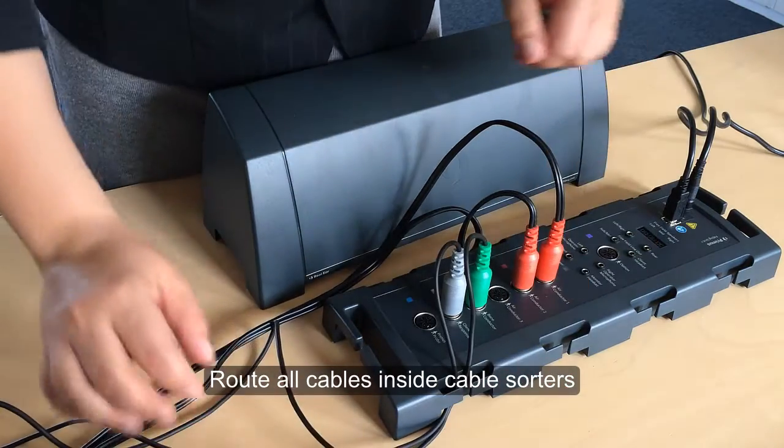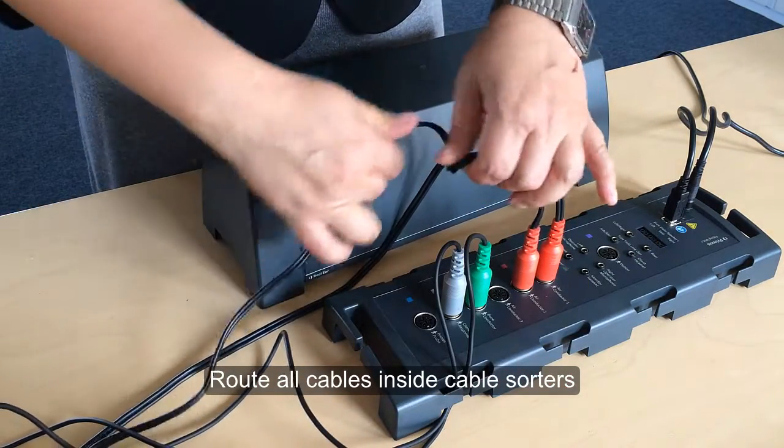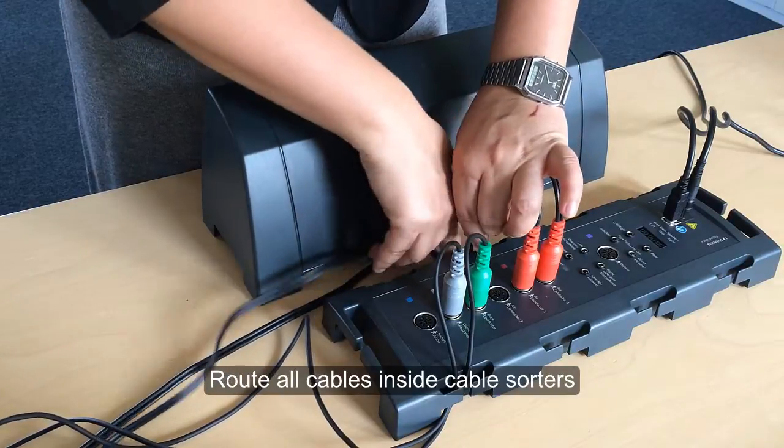Make sure that all the cables are routed using the cable sorter. Once you've done this, you can close the fitting unit using the lid.